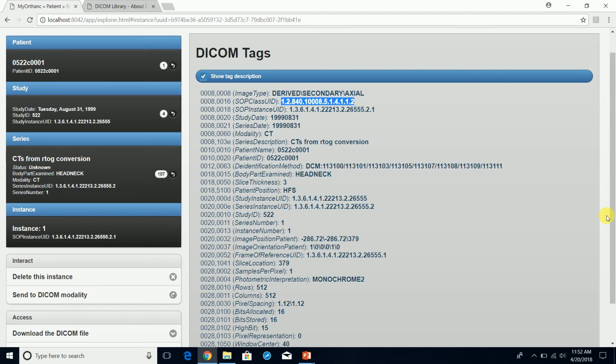You can tell how to do DICOM verification. You know how to tell what the SOP class UID is. You know about DICOMDIR and what it's used for, and how to download a DICOMDIR. So all of these, what we're learning is going to be very useful, and I feel confident that this will be helpful for you in your quest for getting a career in healthcare IT.